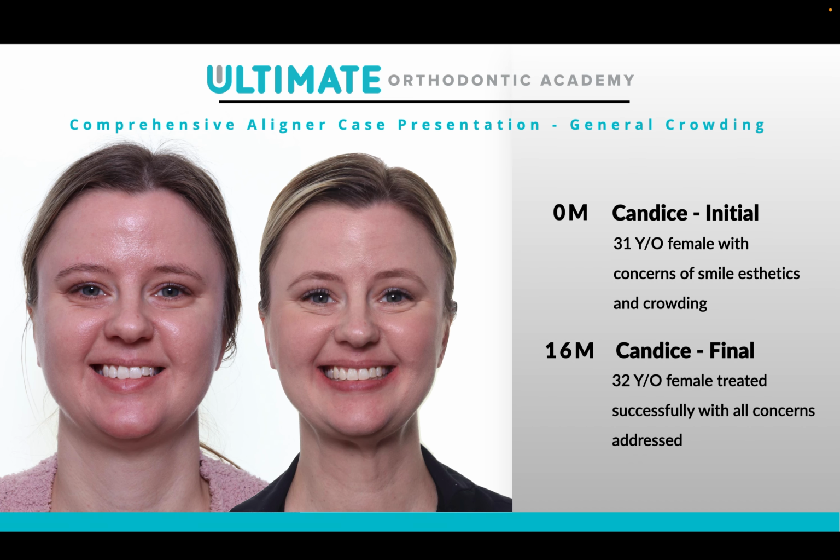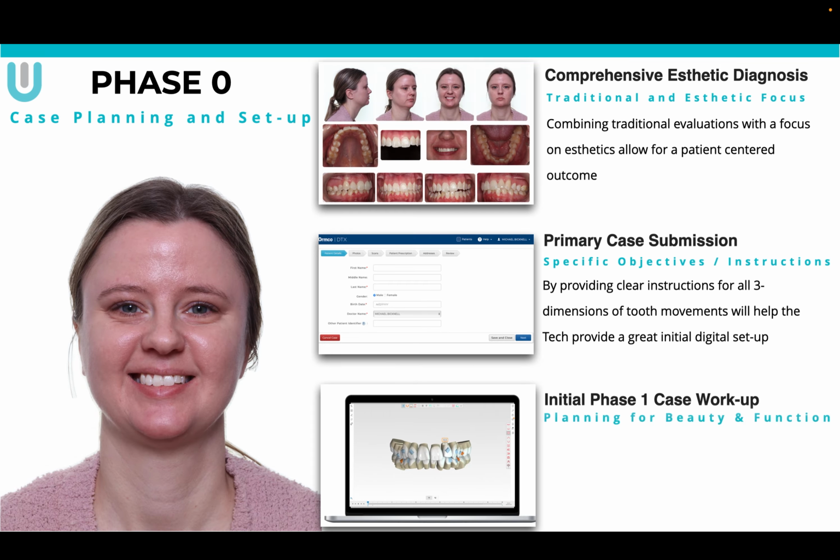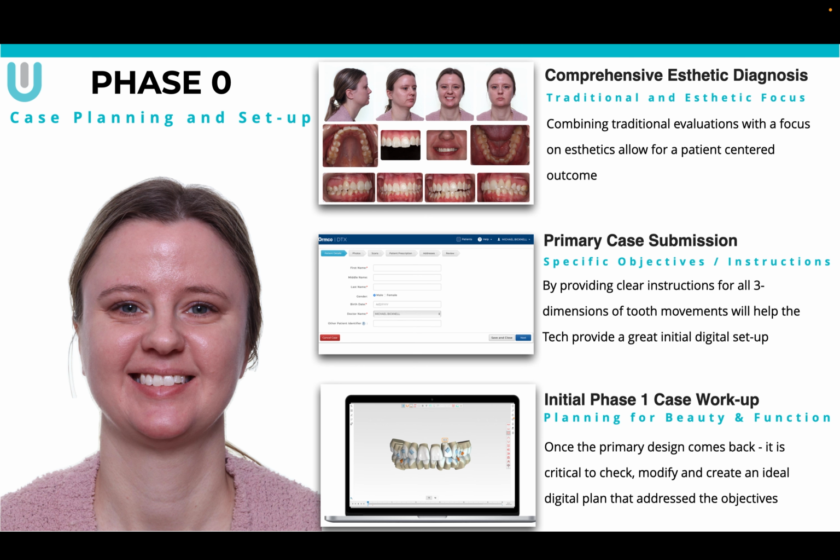So shifting gears a little bit, I know that we do a ton of stuff with braces, but we also have a very busy aligner practice, and we want to kind of showcase some of those cases as well. So let's go through this. So a little bit different protocol. I want to kind of give you guys an idea of how we think about aligner cases.